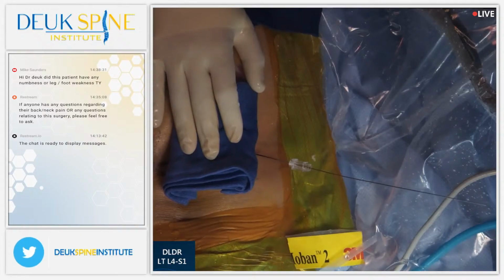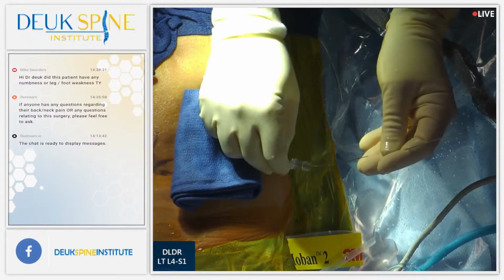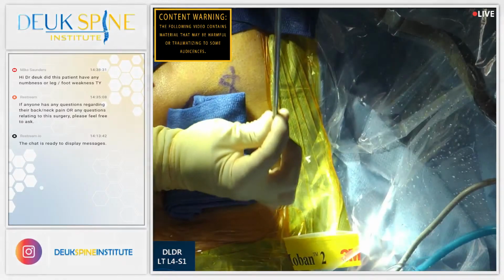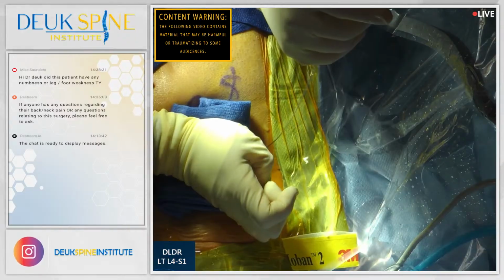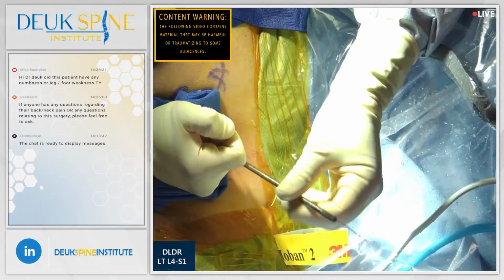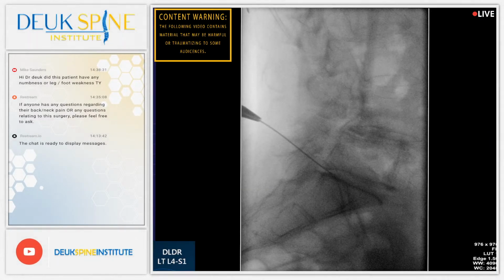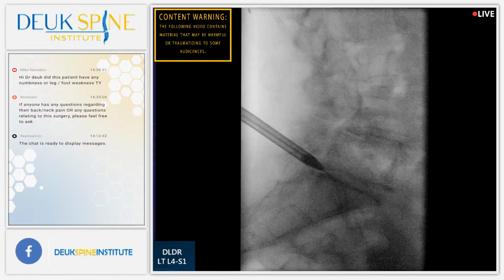Is that it? All right. So at 5-1, it's so collapsed. What I've done is I've gotten the needle placed right at the back of the disc, but I didn't go into the disc. I couldn't get in because of the angle and the fact that she was awake, kind of fighting me, if you will. Relax. Shot. So now I'm going to bring my dilator down to 5-1. Shot. And we're going to try to get in. Now that she's deep asleep, it should be a little bit easier.